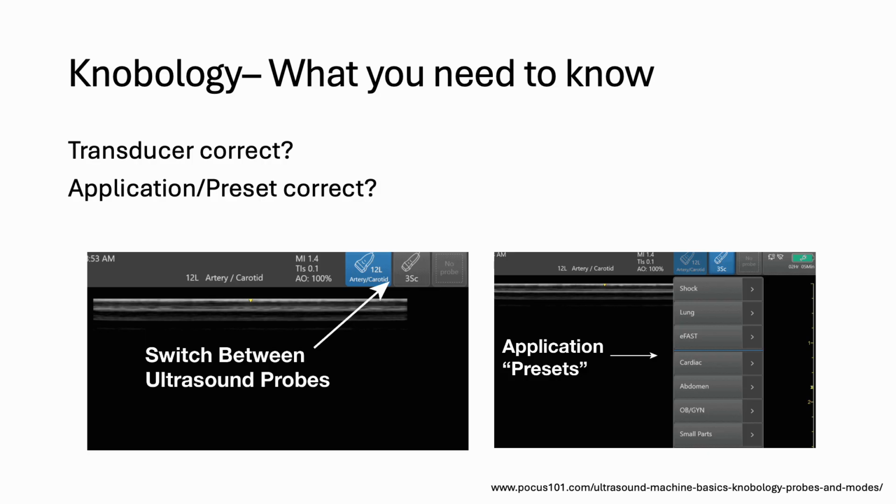It's important that you know these words, because this is the way that we talk about sonos. And so just like when you're in a C-section or you're in a surgery, it's important that you know the right instrument so that you can communicate and take care of the patient the best. It's also very important that you use the right terminology when we're talking about sonography.